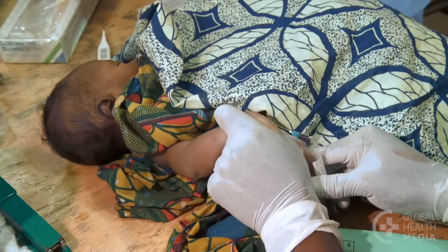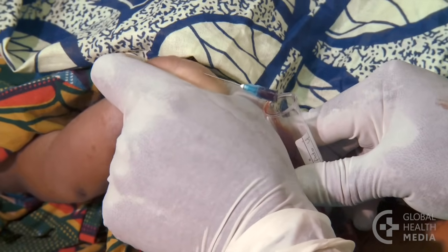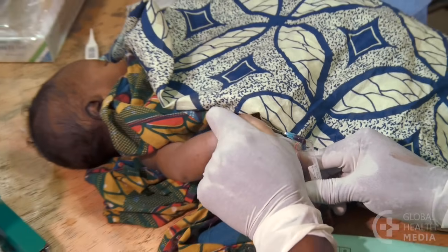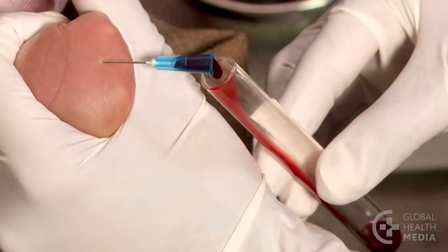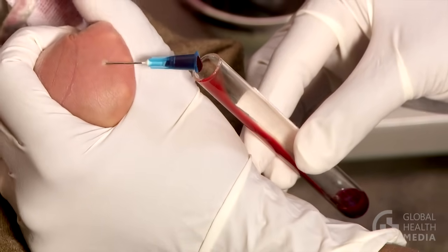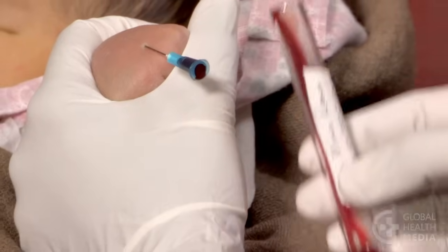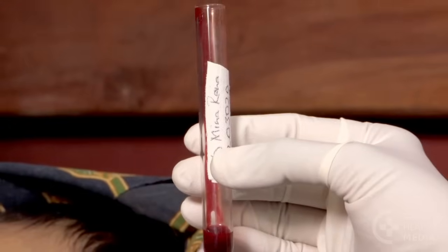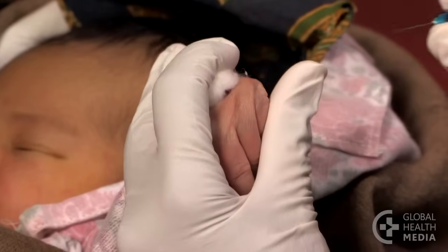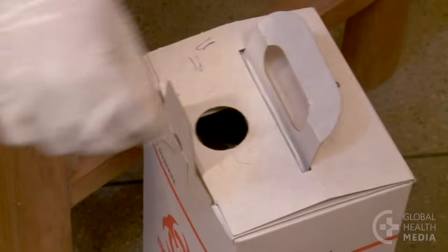Here's another example of how to squeeze the baby's hand. Note that this method cannot be used for blood cultures, as it uses an open tube and so is not sterile. When you have the amount you need, remove the needle and cover the site with a cotton ball, then safely dispose of the needle.